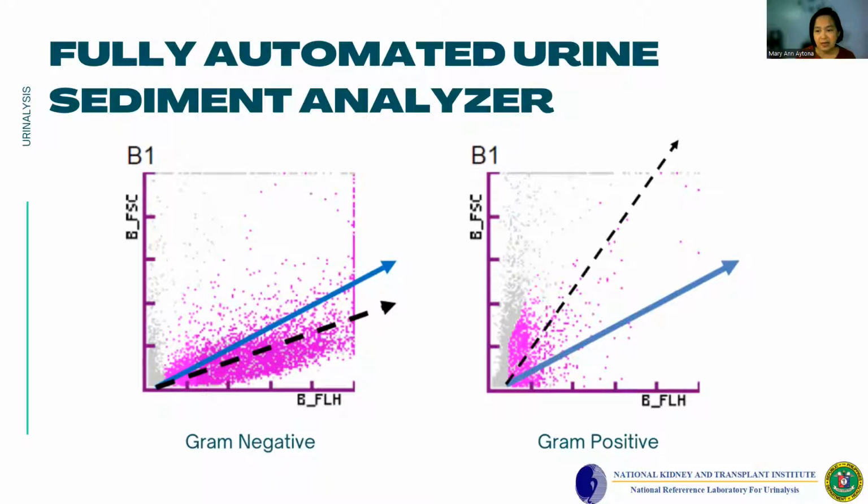In the present study, we had an opportunity to examine the possibility of estimating whether the UTI-causing bacterium is a gram-positive coccus or a gram-negative bacillus, from the angle of the dot distribution pattern with the x-axis of the scattergram produced by the bacteria channel. It also demonstrates good sensitivity and specificity for gram-negative bacilli and demonstrated an improved sensitivity for detecting gram-positive cocci.